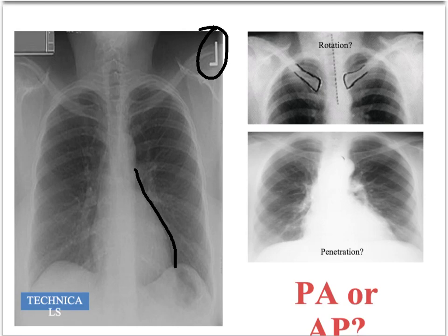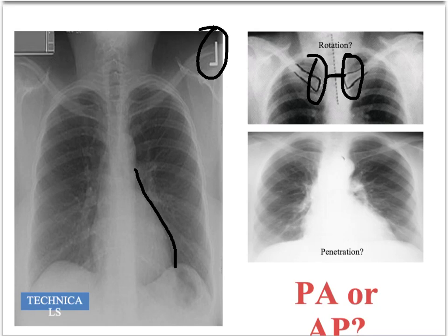Next, we want to know whether the X-ray is rotated. To assess that, look at the ends of the clavicles and assess how far away they are from the centre of the spinous processes running down the middle — are they equidistant? If they are not equidistant, the X-ray may be slightly rotated, which can make structures like the mediastinum harder to interpret.